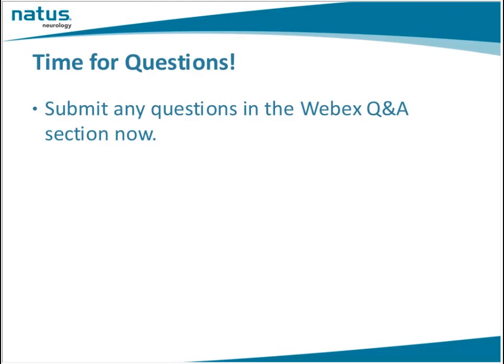Oh, boy. Well, I think we all have days where we feel our exams are not reliable. I know I still do. But let me tell you what we did when we did the stroke trial. We brought all of our TCD examiners, who were not necessarily registered sonographers, against my wishes, but we had some very good nurses, down to Augusta, Georgia, and they spent 2 weeks with us. We had didactic sessions every morning and scanning labs every afternoon. By the end of a 2-week session, they had done about 20 TCD exams.